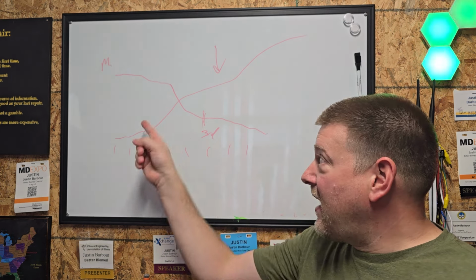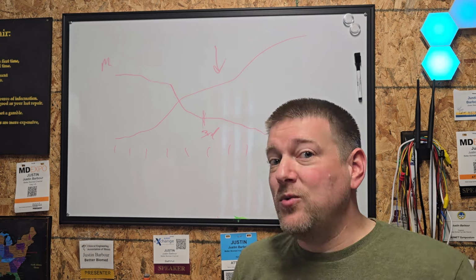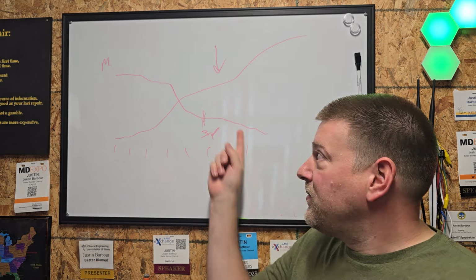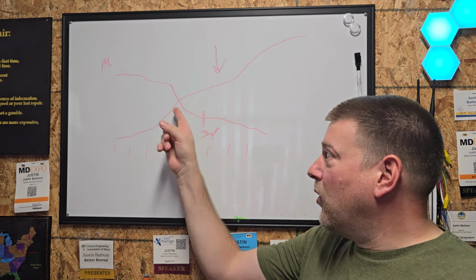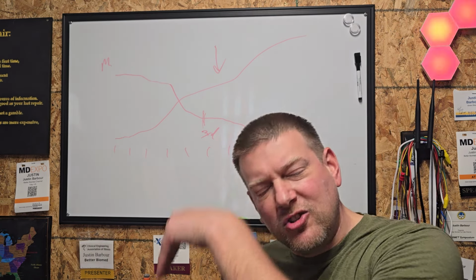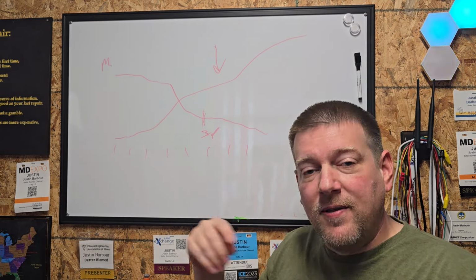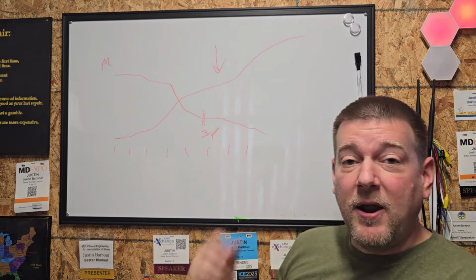But 3 to 5 years is the sweet spot on any medical device when we can get parts and when enough people have knowledge about how to fix it, maybe common failure modes. 3 to 5 years, that's the sweet spot. After that, more and more items end up on the third-party market, and their value is extremely low. And having an extremely low value means that usually it's easier to buy an item on the third-party market outright, entirely, than get it repaired.